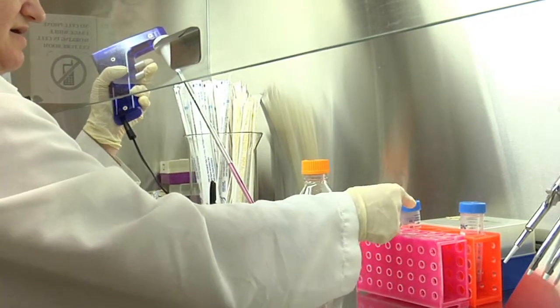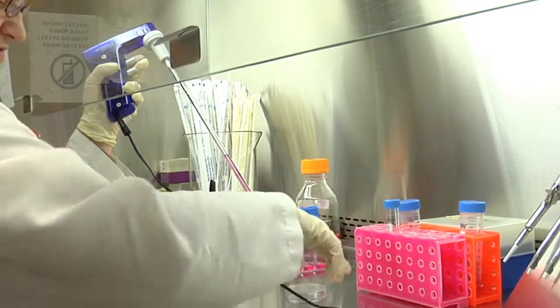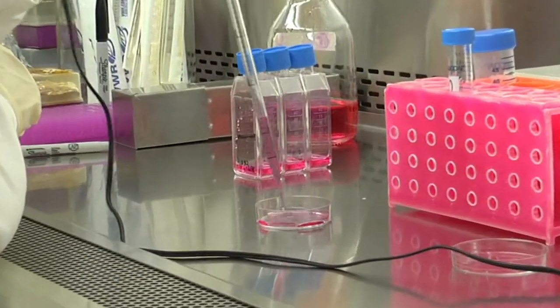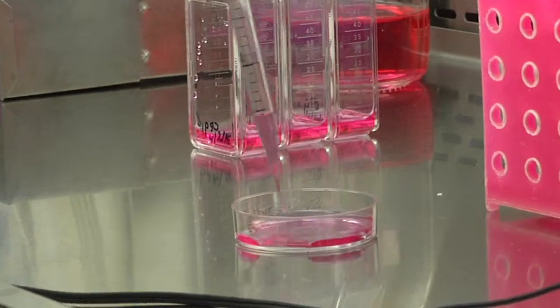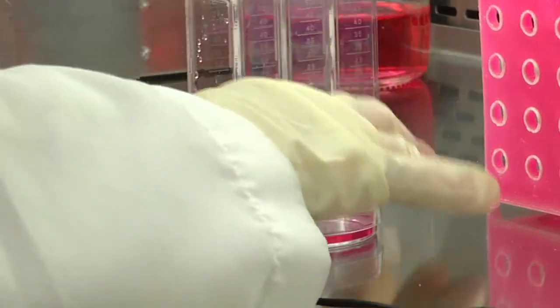Place the lid back on the tube. To add cells to a dish, do it via a gentle drip throughout the surface of the dish in order to distribute the cells homogeneously. Place the lid immediately on the dish.